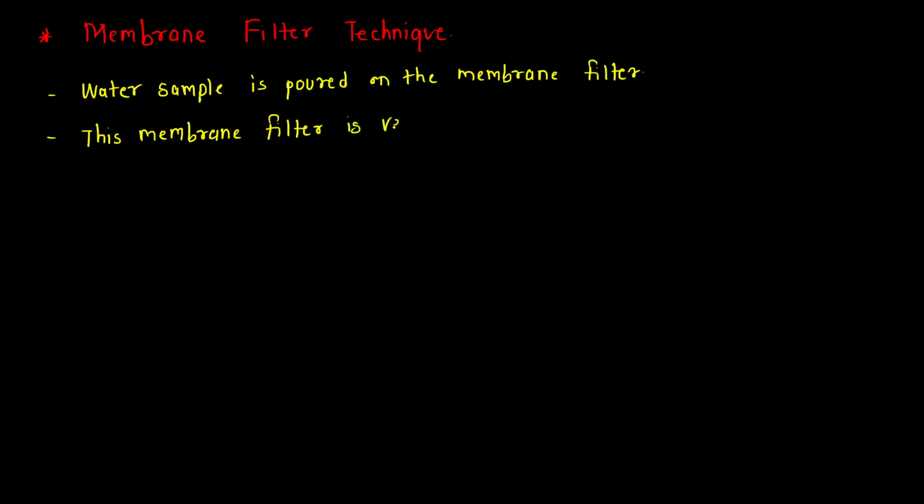is very fine, or you can even write it very fine. The pore size of this filter is very small.